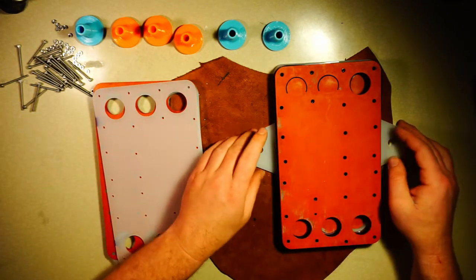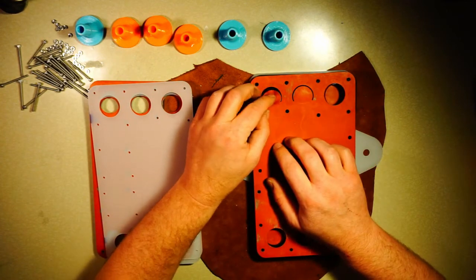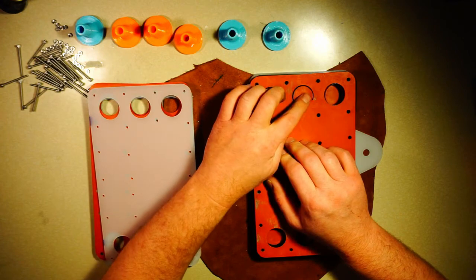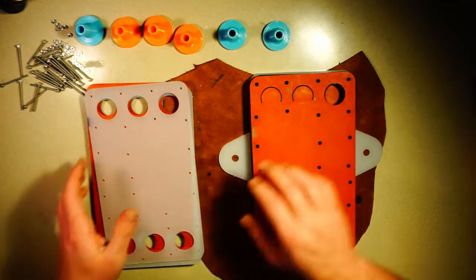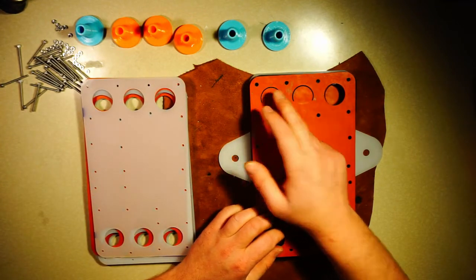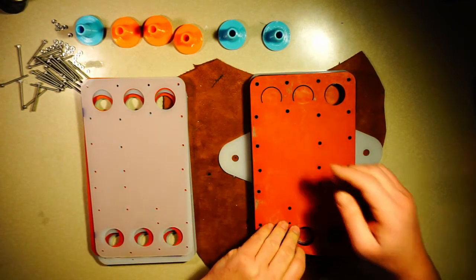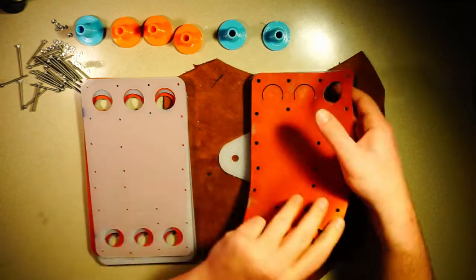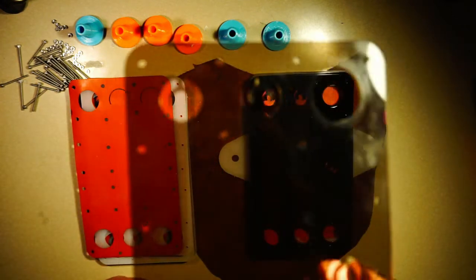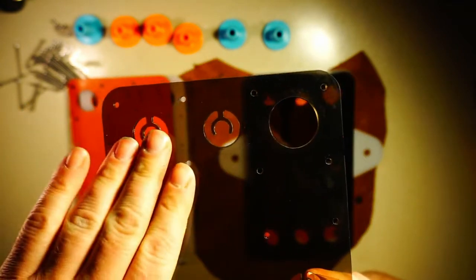And then here we have our first set of valves within the compound valve body. So these flaps are cut silicone, and those two form check valves that can exit. Those are for the PEEP and the overpressure setting. So this is PEEP, this is overpressure. And so gas can flow out this way, but it cannot flow in this way. So if we remove this, we can see here we have these little supports that prevent the check valve from being sucked in.